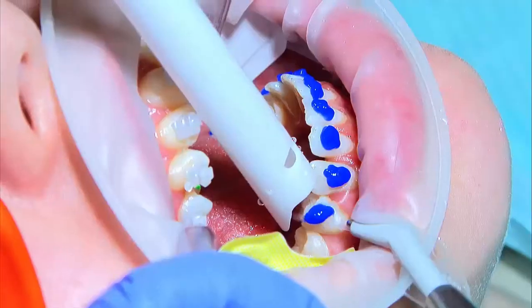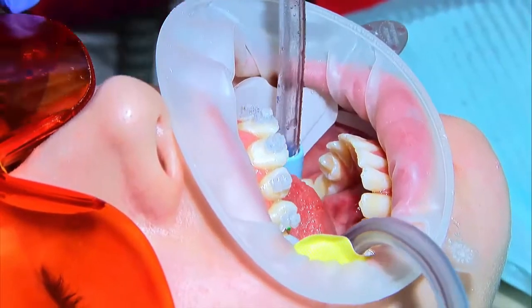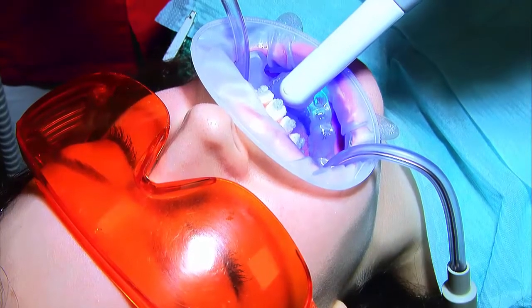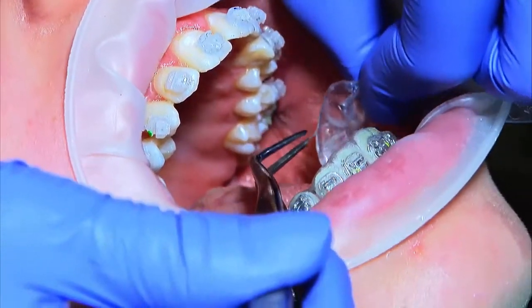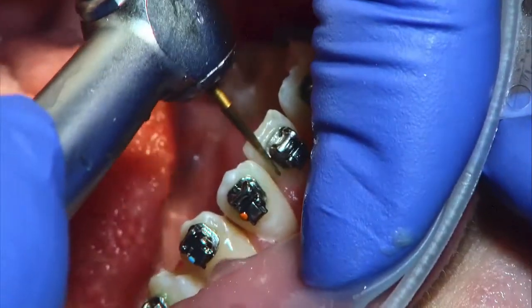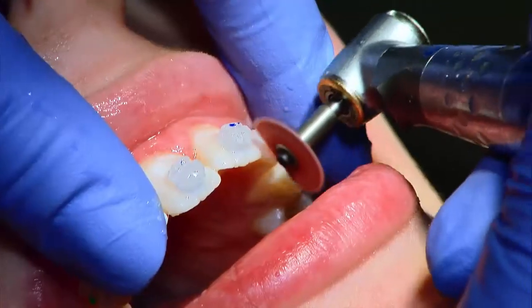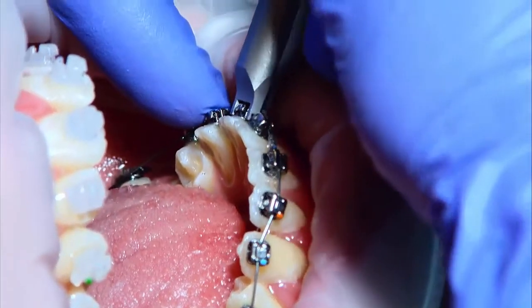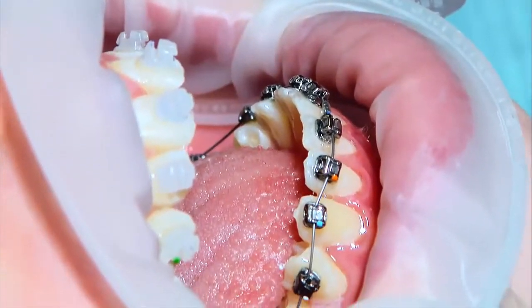Now is the time to bond the lower arch. Etch, rinse completely, use suction to remove excess moisture, dry with the warm air tooth dryer, apply the bonding agent, seat the trays, and cure occlusally and gingivally. Remove the hard shell, cure again, and then remove the soft layer. Once the trays are off, check each bracket with a scaler to ensure bond strength. Then remove flash with a polishing burr and check interproximally with floss. Before the wires are inserted, this may be a perfect time to call the clinician and confirm the placement so the patient feels involved and can ask any necessary questions.